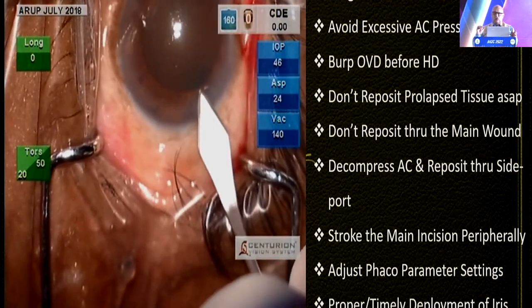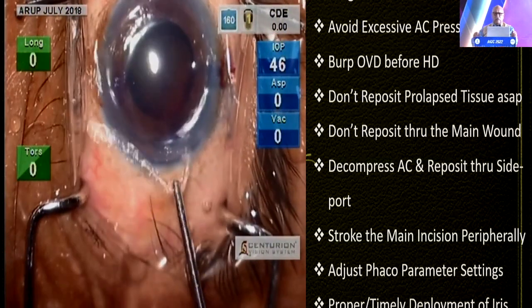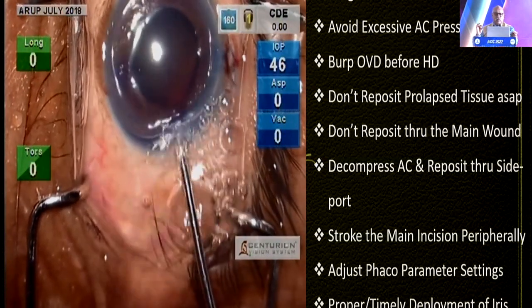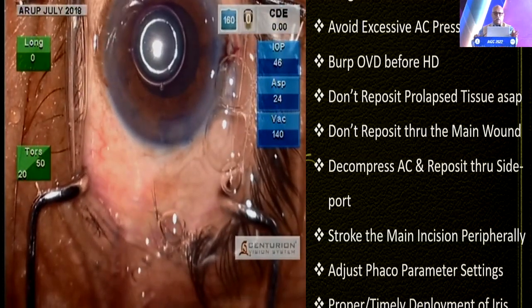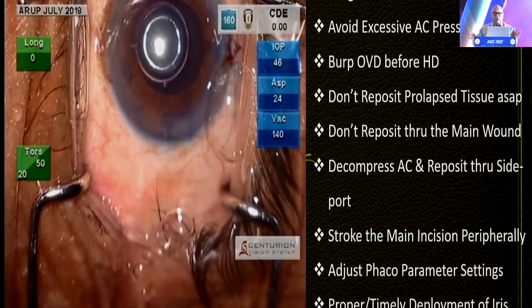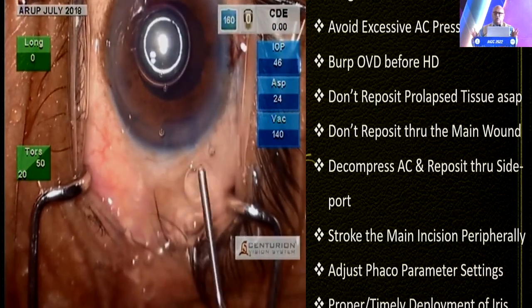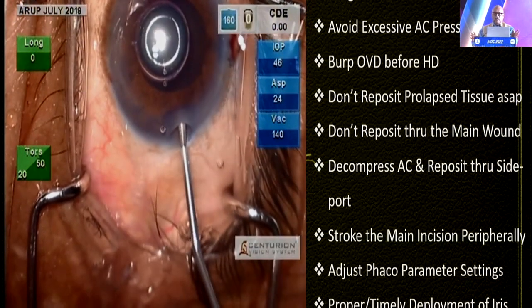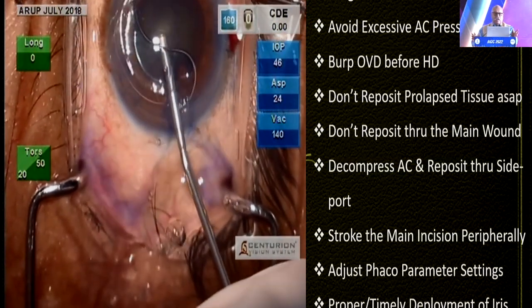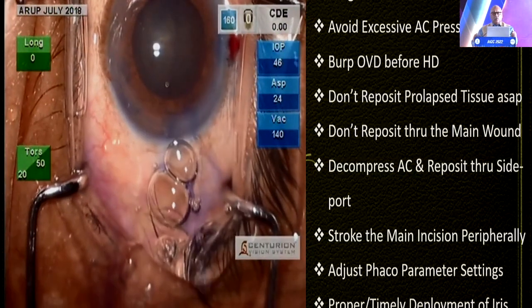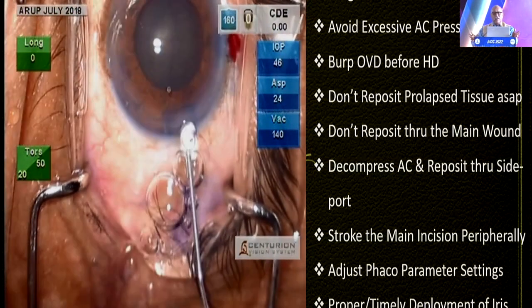Be very, very careful when you push your blade through the temporal clear corneal incision — as I mentioned, it has to be long. When I stained the anterior capsule with trypan blue dye, I realised the pupil was coming down, and I was really on my guard. So I used a soft shell technique — it is very important to use a good quality dispersive agent inside the eye. Some viscomydriasis happened in this patient, so I was sure I would get an adequate rhexis.